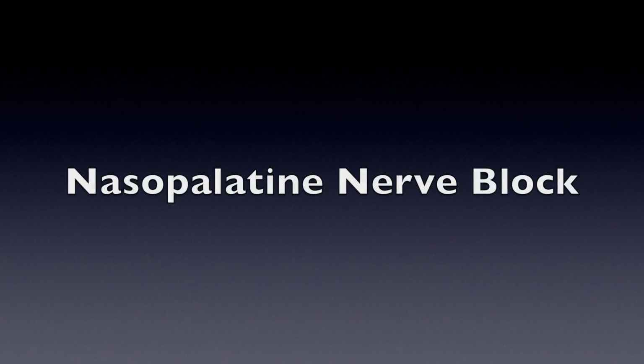Some technique suggestions for palatal anesthesia. The gate control theory suggests a two-stage technique may be helpful for pain management. One option would be pressure anesthesia for 1 minute following topical application for 1 minute. The clinician should maintain pressure until initial needle penetration and initial blanching. Once that has occurred, the clinician may flip the Q-tip around and support the syringe.